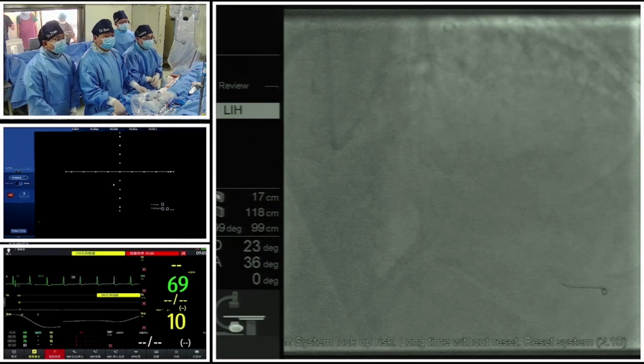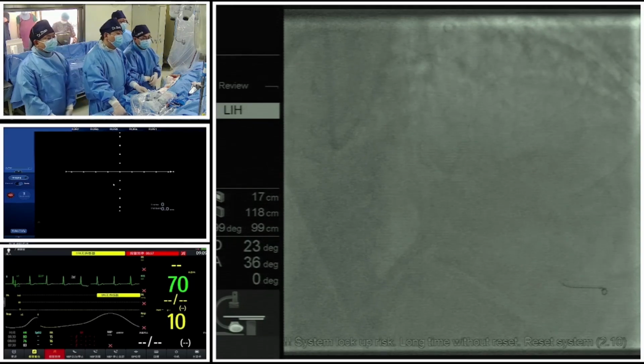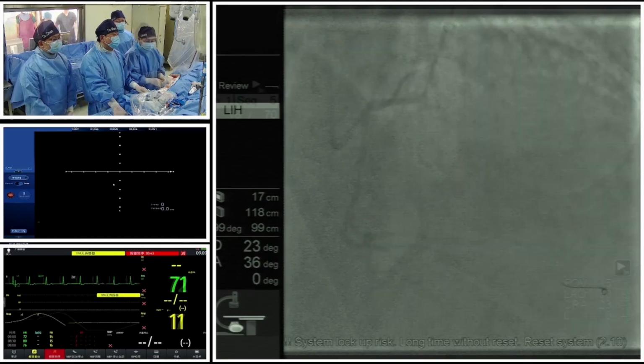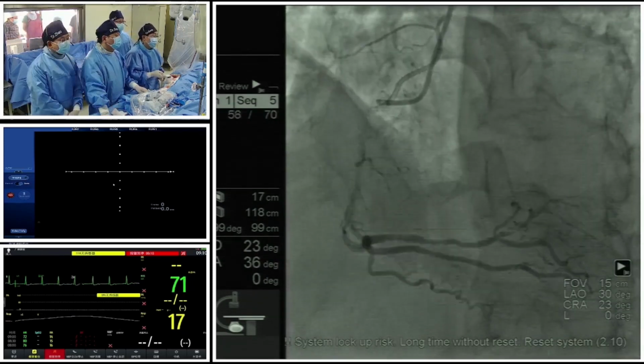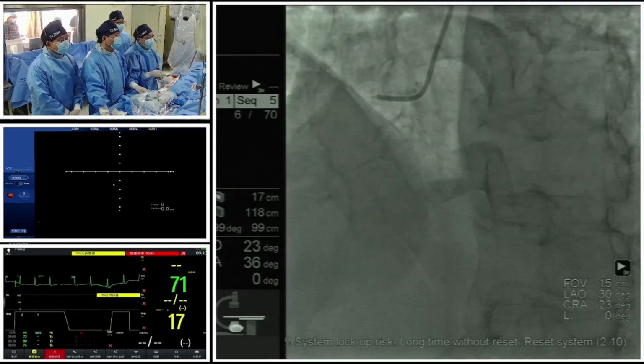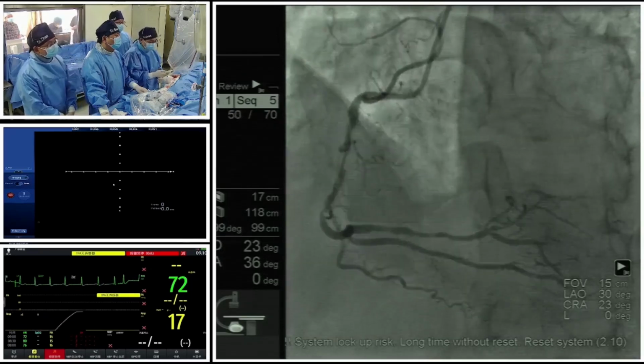We can say that if we implanted two stents in the RCA middle segment, the QFR could significantly increase to about 0.92. And in fact, for this patient, firstly, we completed the RCA PCI with intravascular imaging guidance. We completed the RCA PCI and implanted two stents.